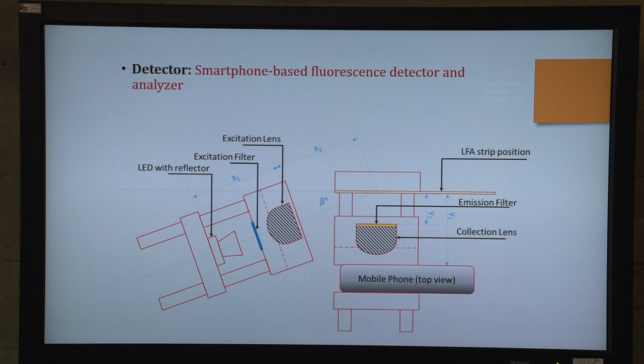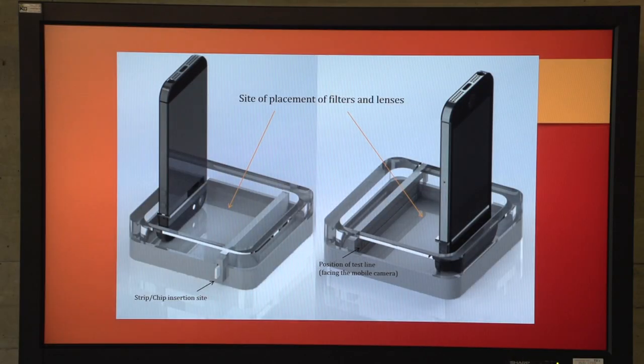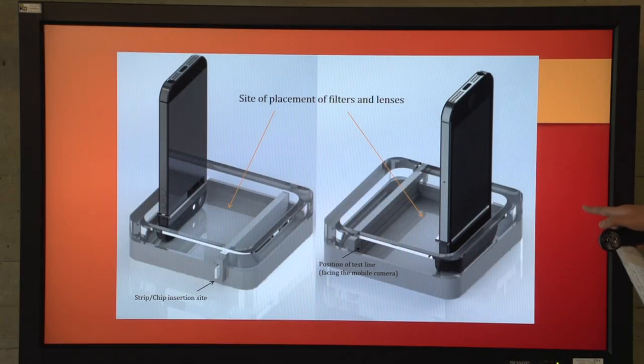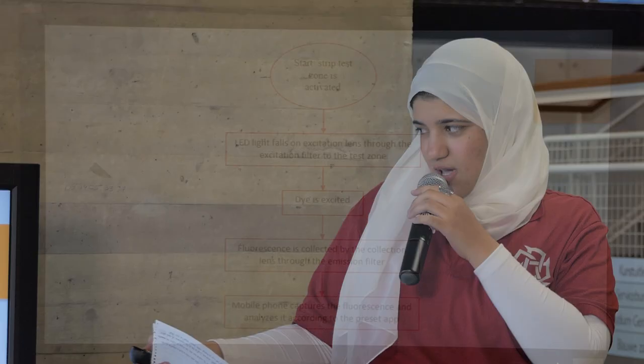This mobile phone has an application, specially designed to analyze this fluorescence signal and match its intensity on a preset curve, where you can find the level of NT-proBNP in your sample. This is how the design of the device will look, minus the filters and the lenses, because they go there. The mobile phone fits in there, and the test strip fits right there, and the camera and the test line face each other. This is how it works.